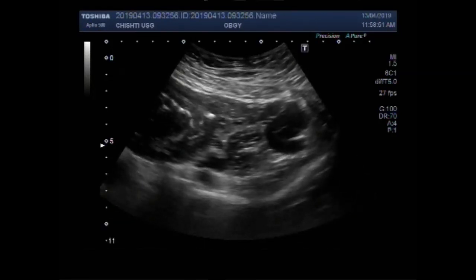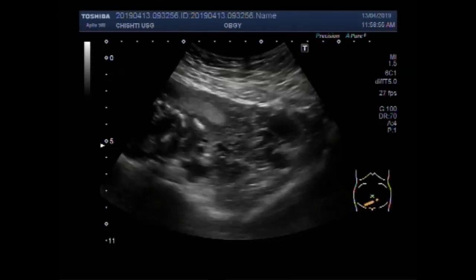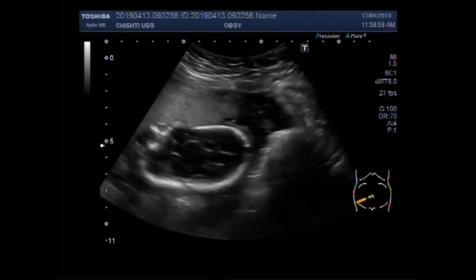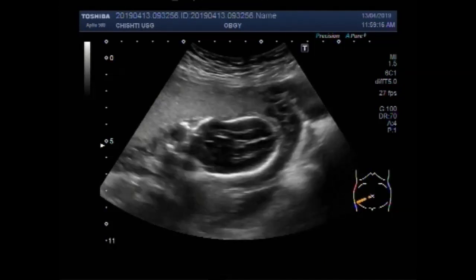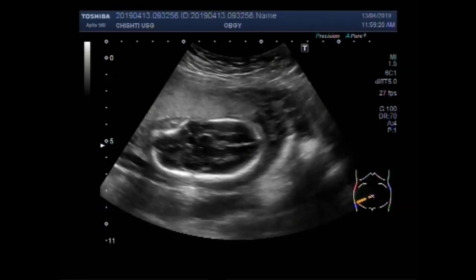You can see the fetus. This is the head of the fetus. You can see the skull bones are overlapping on each other — that is a positive Spalding sign. This is the placenta, and again you can see the fetal skull bones.